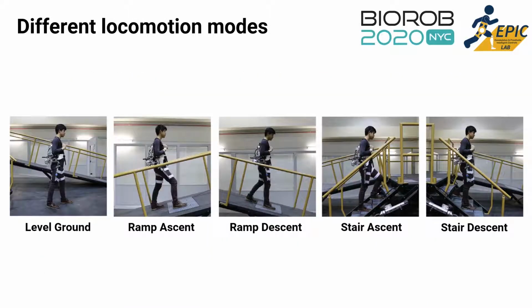One of the key user state variables that is directly correlated with exoskeleton control is the locomotion mode, such as ramps and stairs. These are important environmental information, as these are some of the common locomotor tasks that a person may experience daily. Therefore, accurately understanding the user's intent during locomotion is paramount to maintaining maximal human-exoskeleton performance.